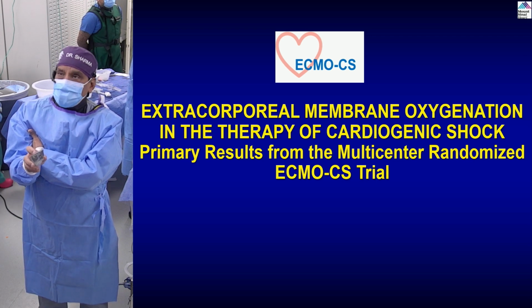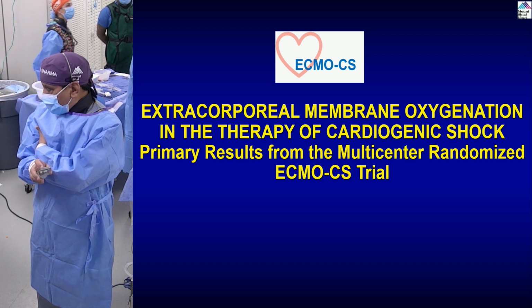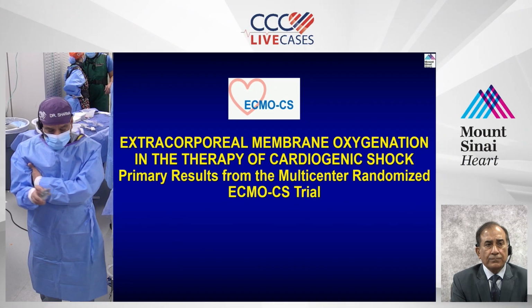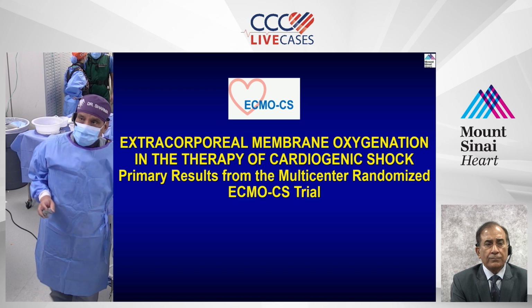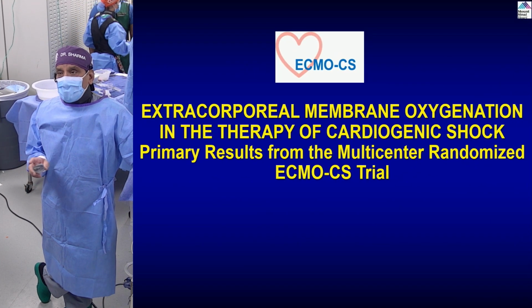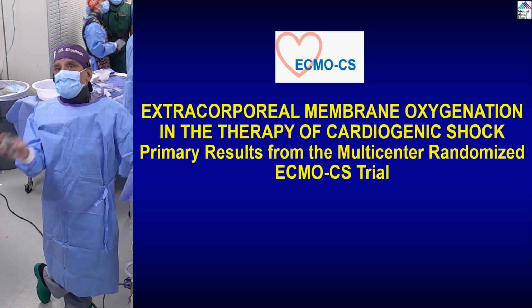Now, the third study. Could it be related also to the size of the vessel? Yeah, so this is the case. The average size was 3+ millimeters. So they have straightforward vessels where you can deliver the IVL directly. As you saw, IVL was delivered in all cases.